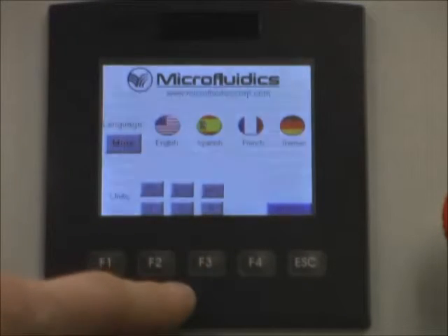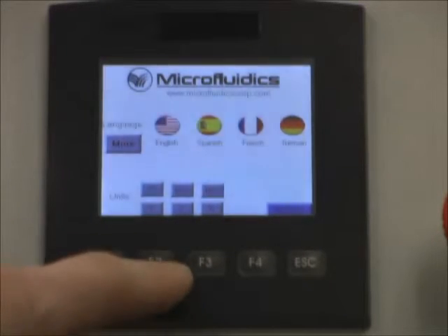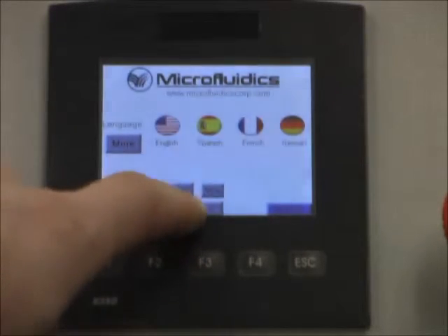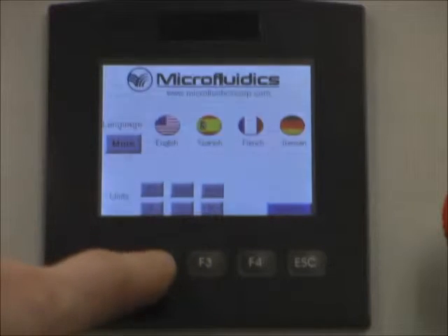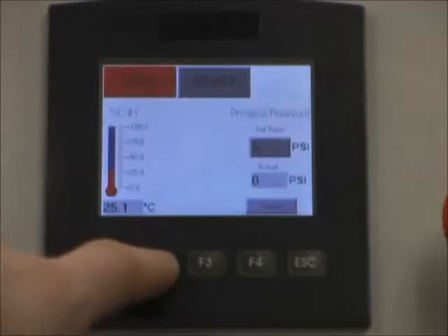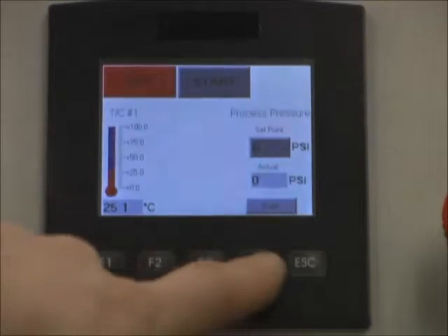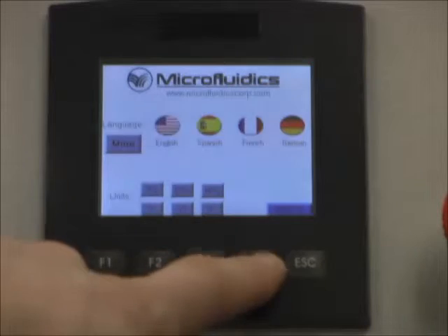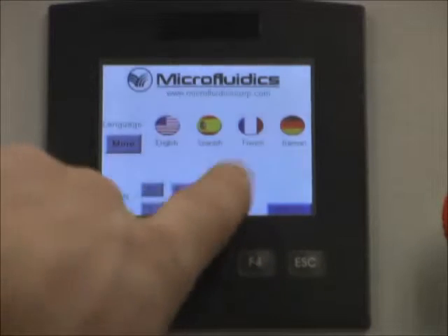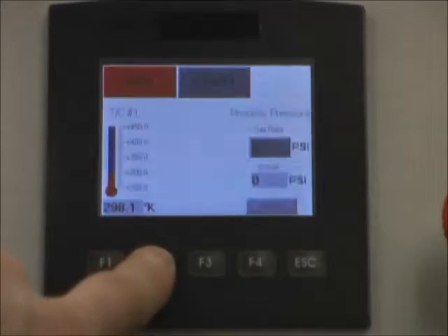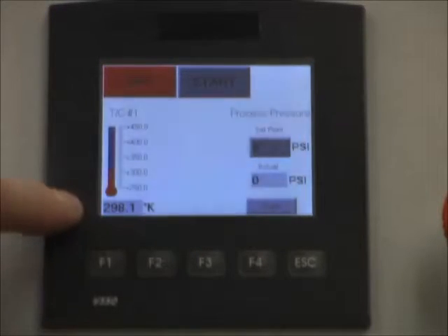The same applies for temperatures — we can select Fahrenheit, Celsius, and you can see we are now in Celsius units. There is also Kelvin available, and we can see the Kelvin units here on the screen.